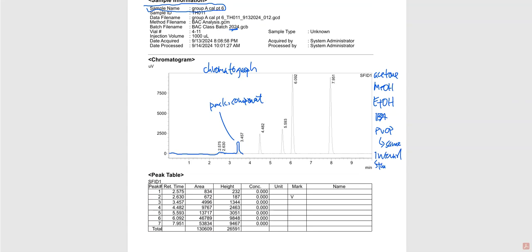So if you've taken CTC 150, you should know how to handle the internal standards when they show up in the laboratory. And if not, we're going to talk about it again, because I guarantee you probably didn't know or feel really good about the internal standards at that moment. And we'll show you how to process the internal standards here with a set of data.